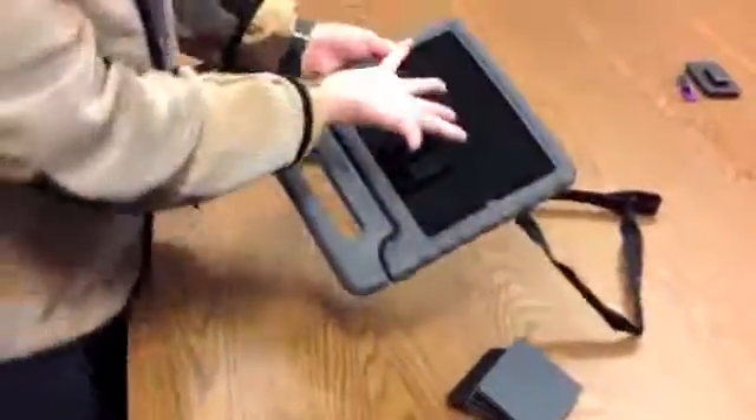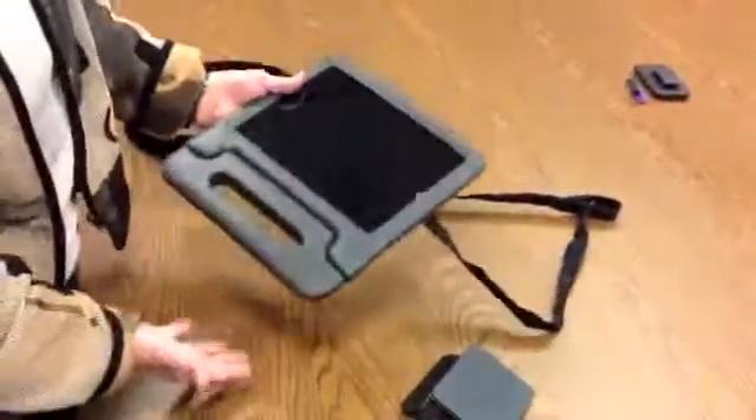Hey! I want to show you how you can turn an iPad into a wearable iPad. This is great for somebody who wants to be able to use communication apps on the fly.